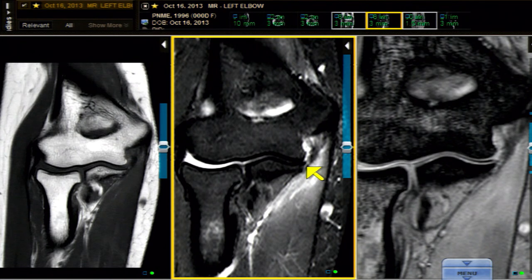To sustain this injury you have to have a valgus force, which puts a stretch or stress on this ligament and compresses the radius against the capitellum — sometimes leading to a radiocapitellar fracture. Fortunately, that did not happen here. This is an example of an anterior bundle UCL tear.